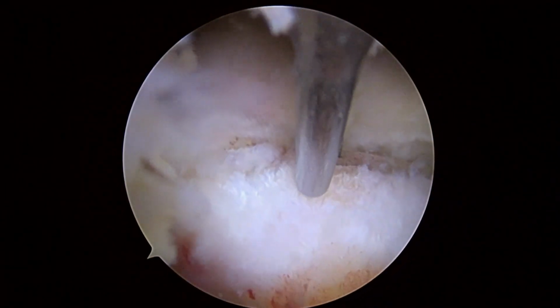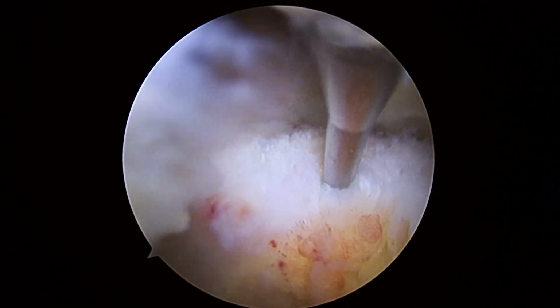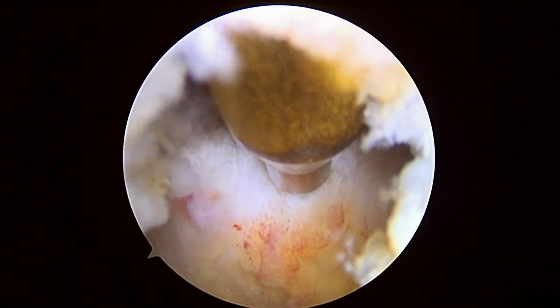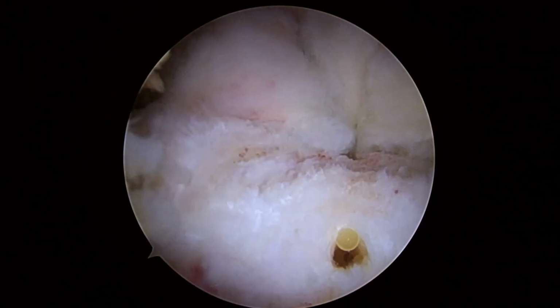And now we're just going to make a little hole in the bone just to release some of the bone marrow elements. This just helps in the healing process. I think with the size tear you have, we're just going to make that one. You can see the little marrow droplets starting to form already.